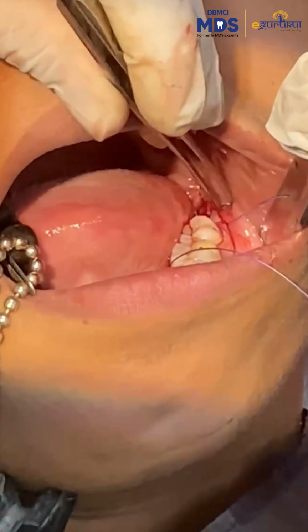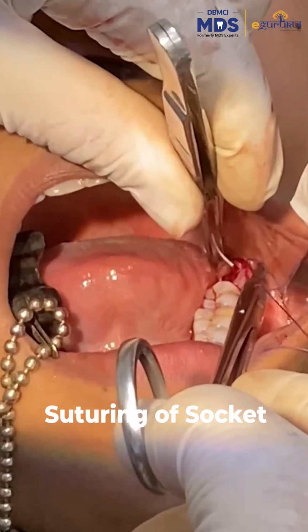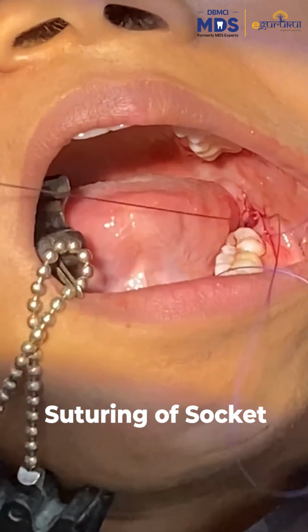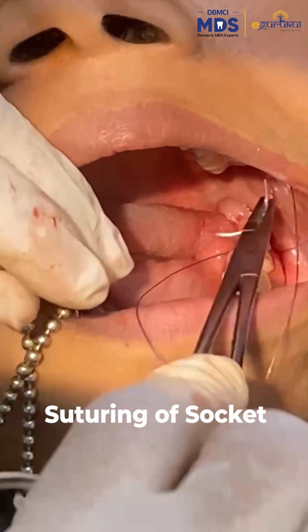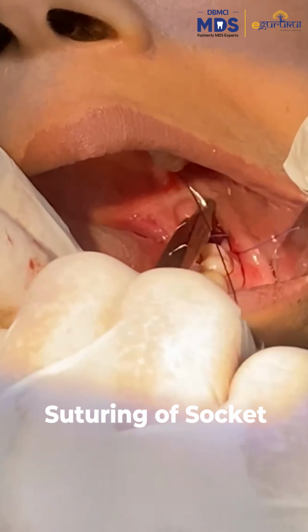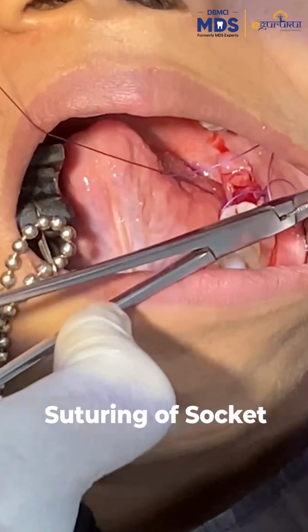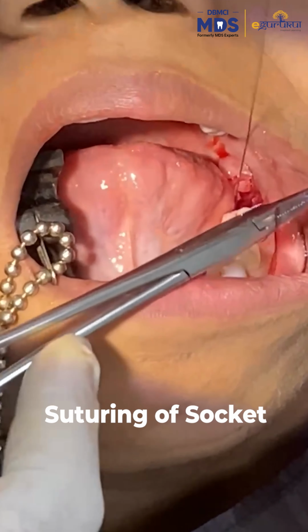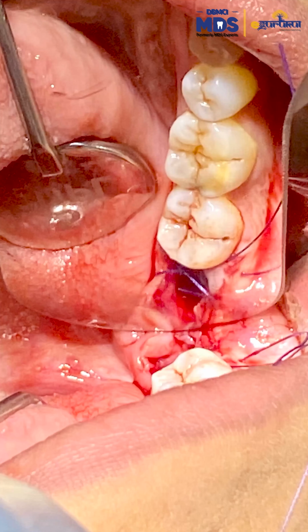Now we begin with closure. I will give a simple socket suture. Socket suture can be best seen when you're standing with me right there and watching me put it. So from the buccal to the lingual side near the second molar, and again the same way one more time going from the buccal to the lingual side. So 2 times we are crossing the suture from the buccal to the lingual, and this will give you an X kind of a suturing which is known as a socket suture. Alright, so we've finished the procedure of third molar extraction, doing all these steps.